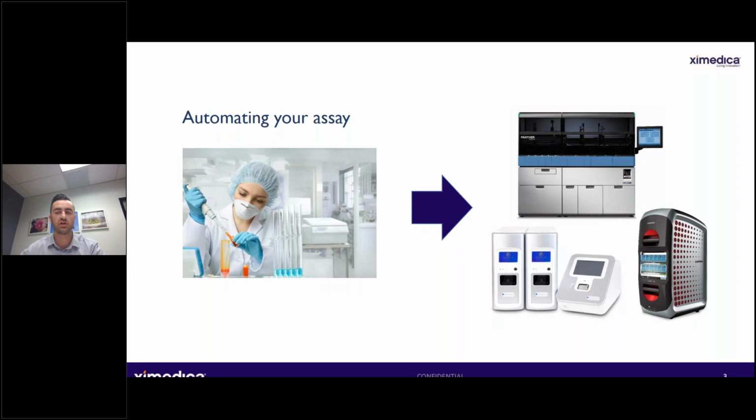So today we're going to talk about automating your assay, maybe more specifically preparing your assay for automation. In the last few years, there's been an obvious trend amongst diagnostic systems towards sample in, answer out systems, or at least sample in, data out systems. This trend is evident across most diagnostic markets, from those requiring high throughput systems like the Panther Fusion shown on screen, down to those in need of lower throughput instruments like the Luminex Aries.